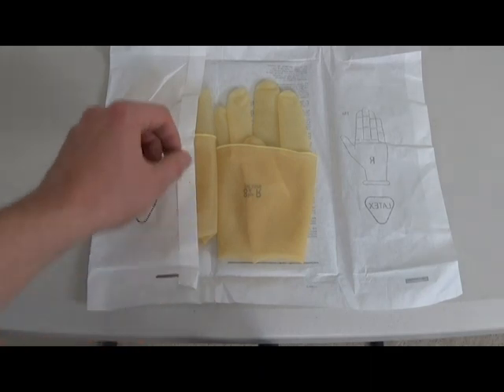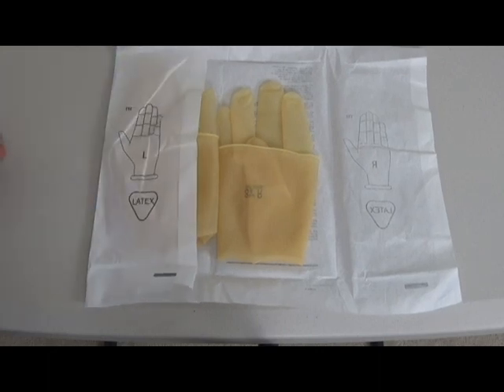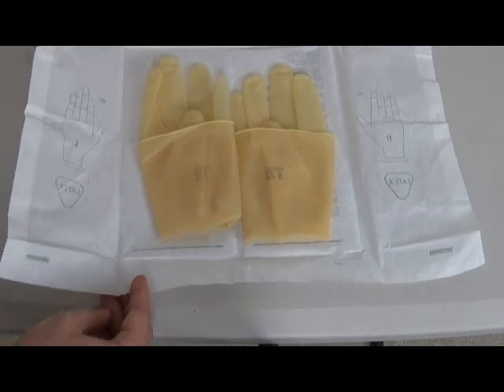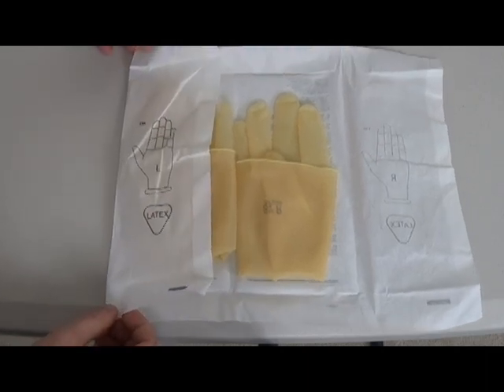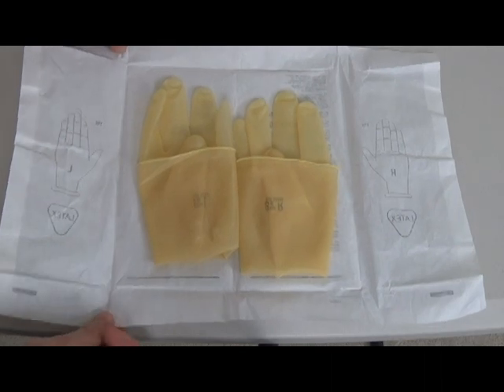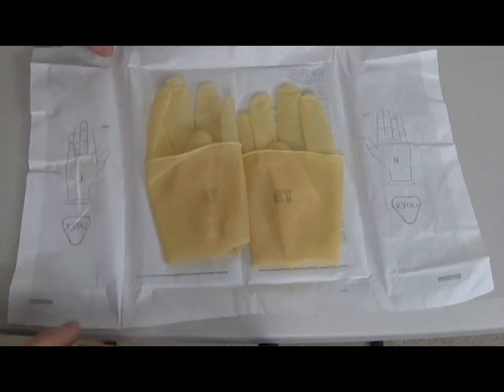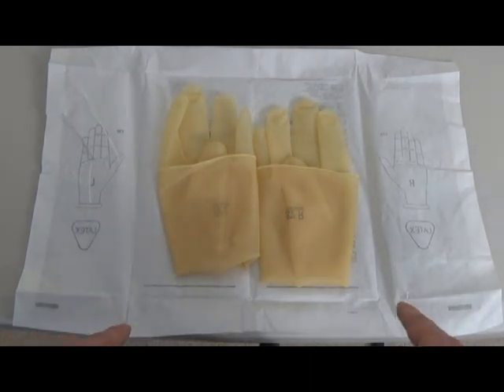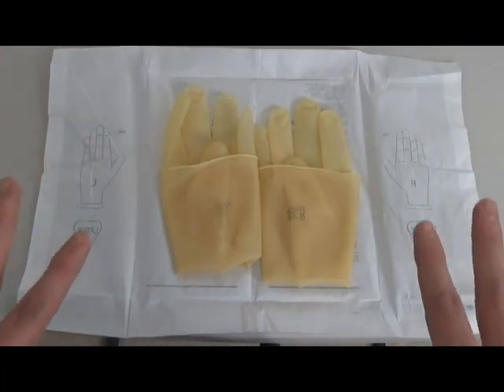Of course, like I said, if you grab from here, even if you manage to open it without touching the glove, the other problem I see happening is it flips back on itself. And then guess what? That's contaminated and that's not sterile anymore. So even if you're not going to pinch it down here and you're in a hurry, try to grab it at least from the side, so if it folds back on itself, it still stays sterile right here. That's really important, and I feel like it gets missed a lot. So, pinch it, fold it on itself just like I did with the other side. And just like you see right here, it's not going to go anywhere. It's staying put. Obviously we have a little question in the corners at the top, it's a little iffy, but the middle, where the gloves are, is sterile.